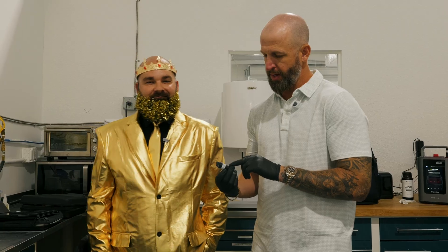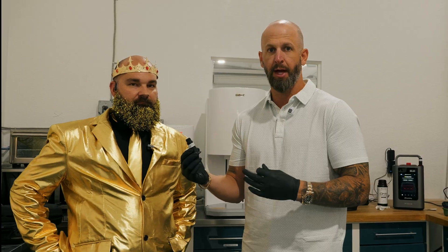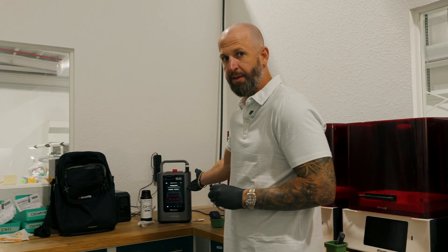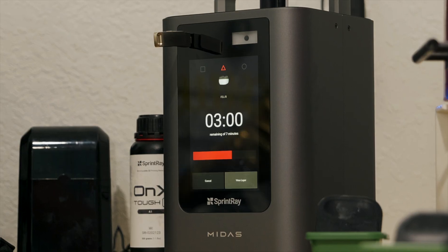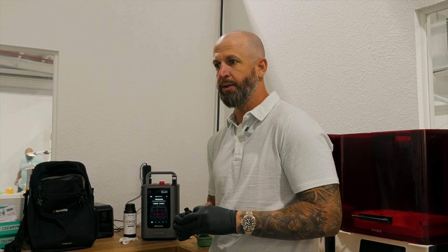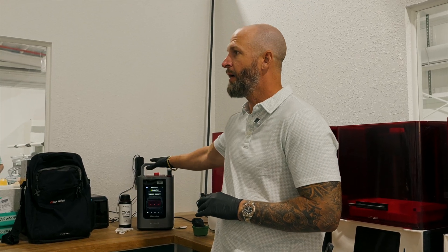I've got Bruce here with SprintRay. He and I were in Orlando last weekend at the FACD meeting. Bruce brought in a new capsule of resin for the Midas printer — this little guy here. We've got over a thousand prints since we got this in the lab. Some of the things I really think is going to be great for digital workflows: in-office printing. We do a lot of work with oral surgeons, periodontists, and people placing implants.